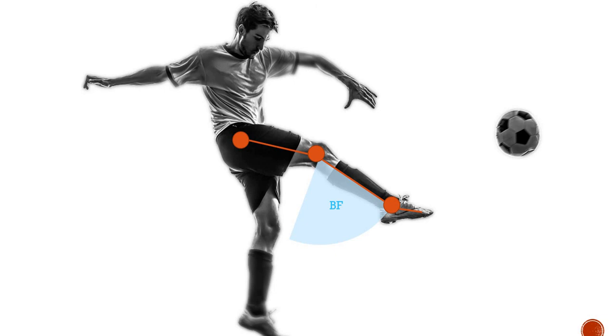And the biceps femoris does the majority of the work, but what we've been able to understand is that the semimembranosus is engaged for the last portion of knee extension. So where this person will move from this position to full knee extension, that is the semimembranosus that is fully engaged, well, not fully but near as, from this point onwards, from just about 15-20 degrees flexion to full extension.